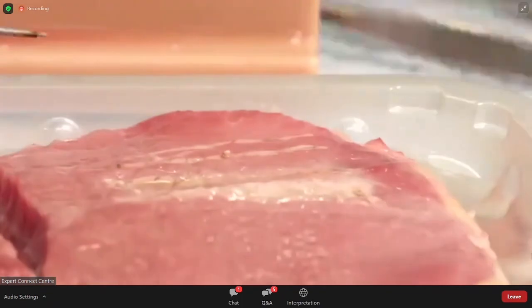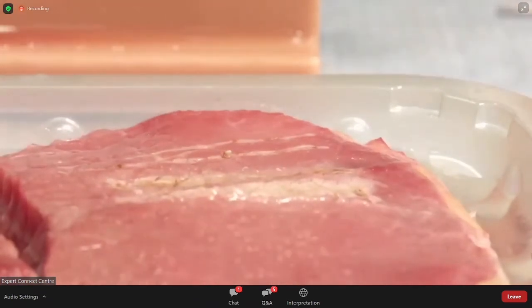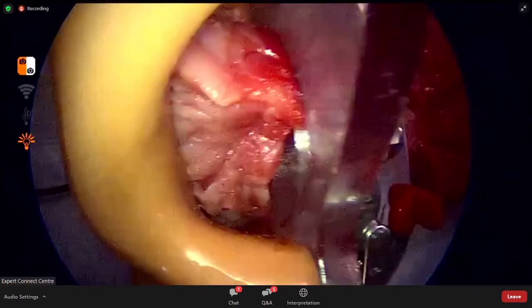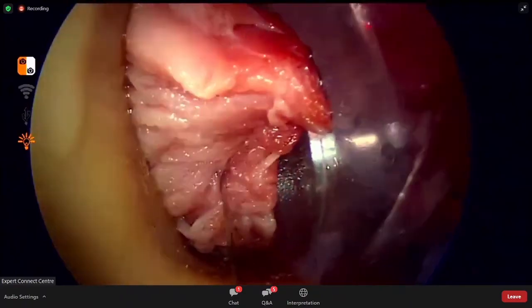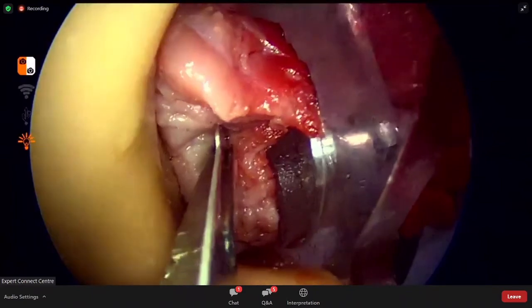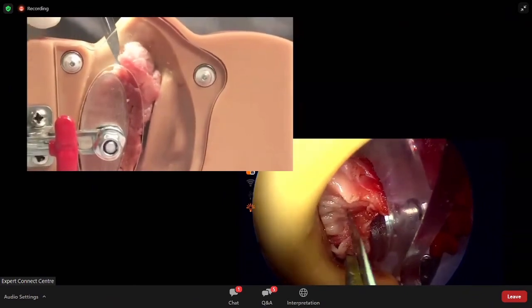Okay. Now, let's transition ourselves to the endoscope, because I'll then show you how I typically will do it. So again, this is a simulated inferior turbinate, step incision with an 11 blade, again, right down onto bone, and you stay medial to the turbinate bone. And this area here will typically bleed.